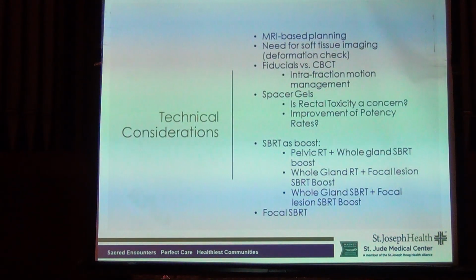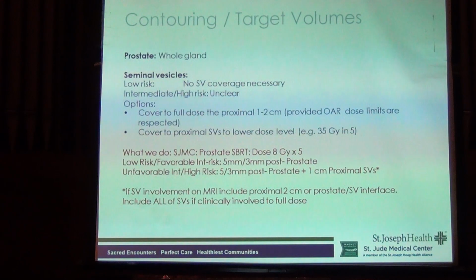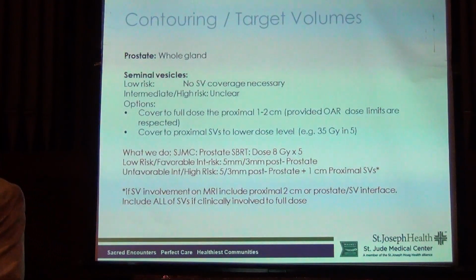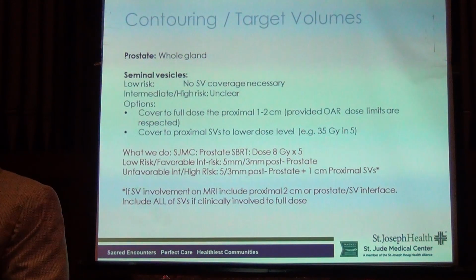So there are some other technologies we can help move things along. There are different types of machines. People always ask me, well, do you just do the tumor or do you treat the entire prostate? And I always come back to surgery because prostatectomy has been sort of where people know their comfort level. You don't remove part of the prostate for cancer treatment. You remove the entire prostate. And we do that with radiation therapy.